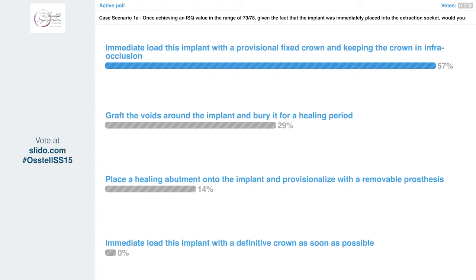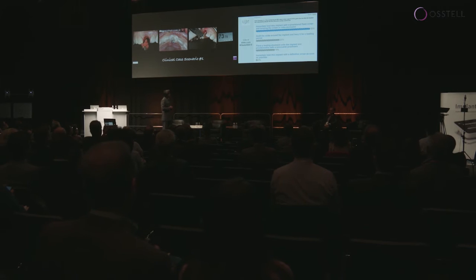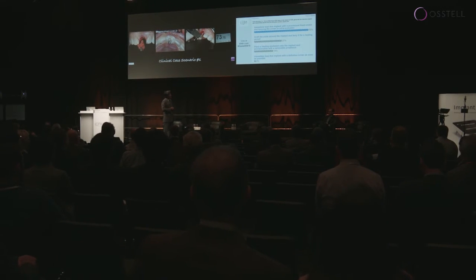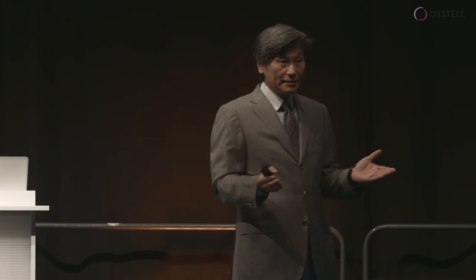Oh, 65% of you say bury the implant, right? No. It says immediate load this implant with a provisional fixed crown and keeping the crown in infra-occlusion. Oh, here comes some outliers. All right, we're still ahead though, huh? And that is absolutely right. Now, why did 65% of you pick that choice? Because I didn't tell you what insertion torque value was, did I? I only showed you the ISQ measurement.